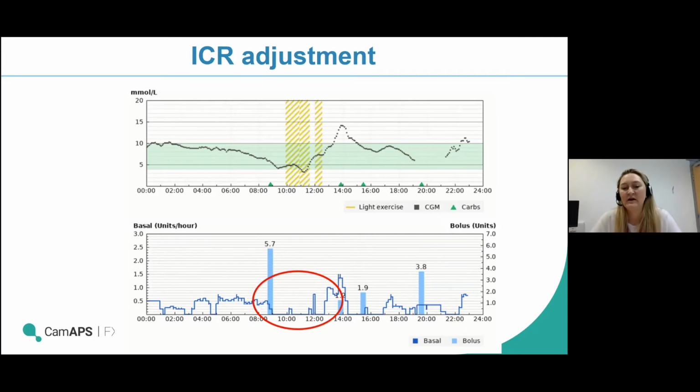So it's a really, really tight, it looks kind of probably more than it actually is on there. And people get concerned sometimes that it's giving insulin when you're already on the low side, but that's the sort of absolute bare minimum the pump has to deliver in an hour.